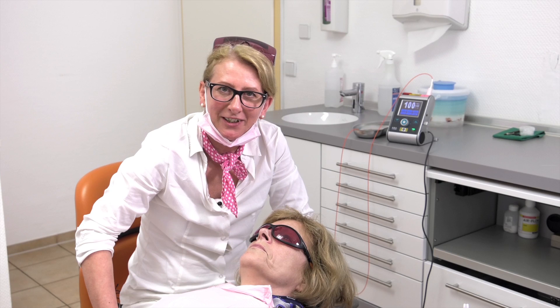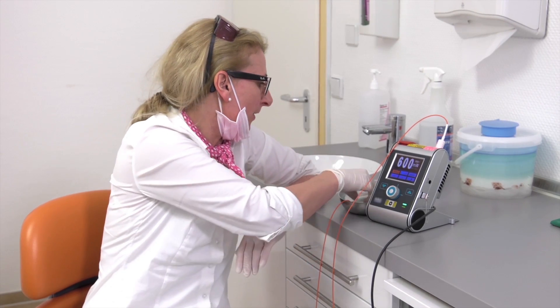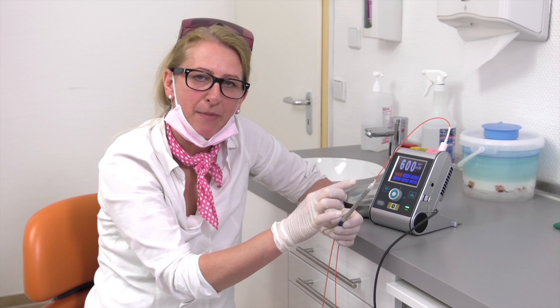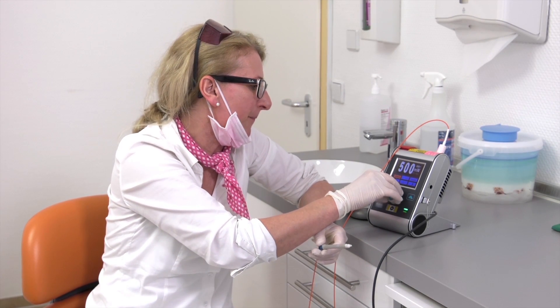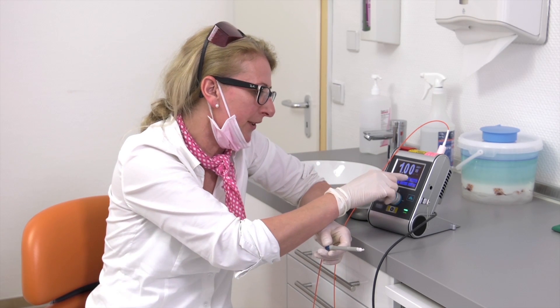Before we start treating the herpes, we will set up the diode laser. We work with one watt, and we use continuous waves. We also use a 300 micrometer fiber. And here are the settings: one watt, continuous waves.